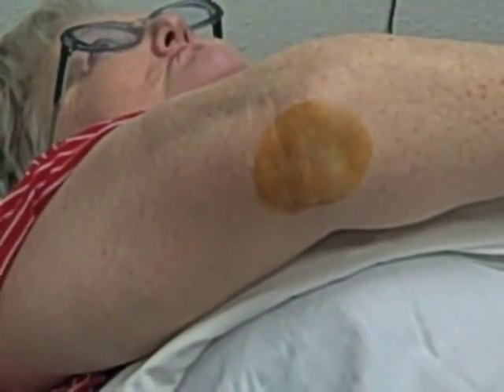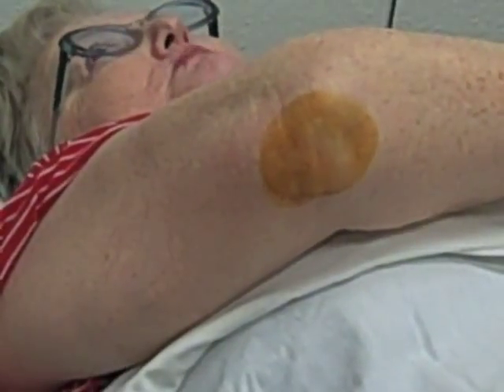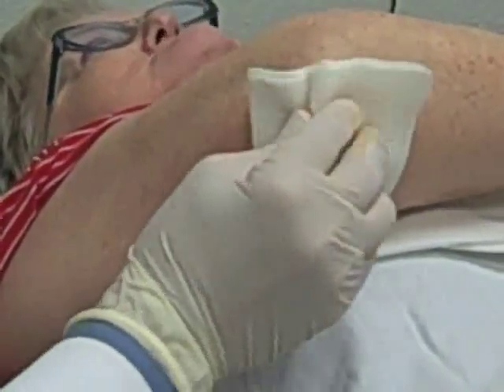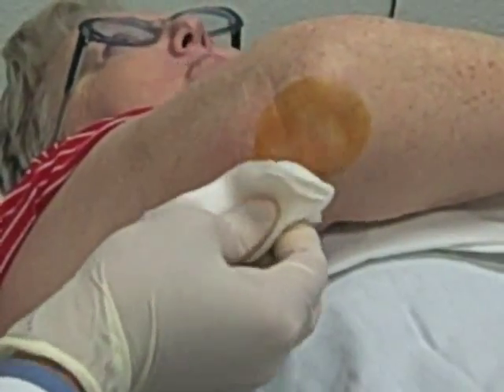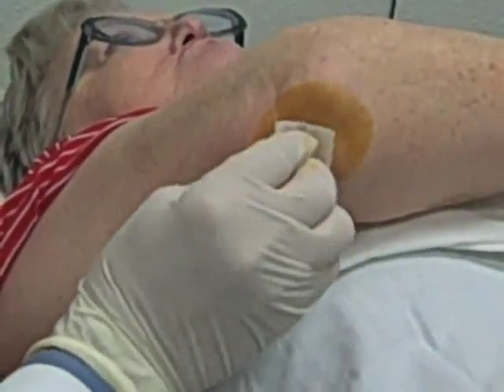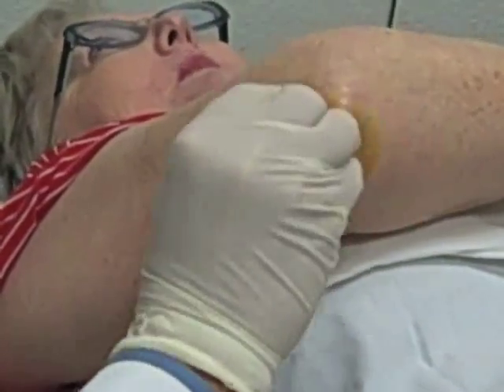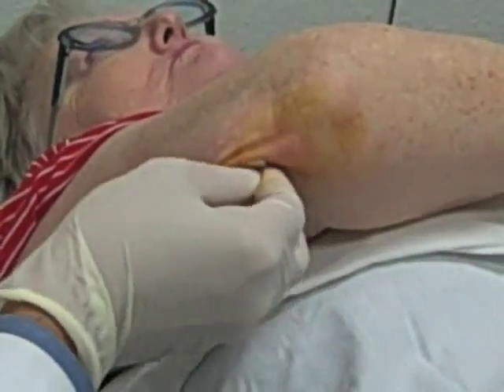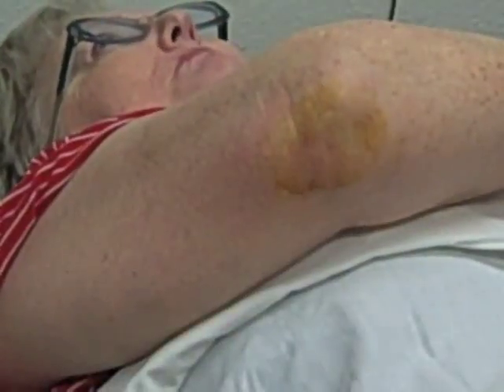After the injection of the medication, we'll apply gauze and a little bit of pressure to stop any bleeding. We'll clean off the excess betadine and apply a band-aid. The patient will be given standard post-injection instructions.